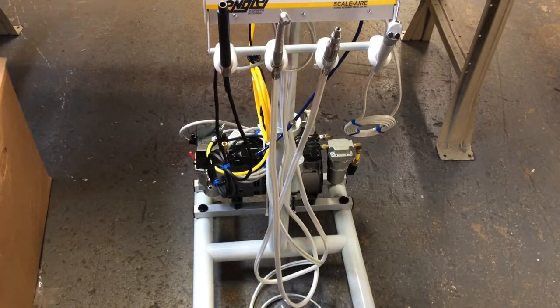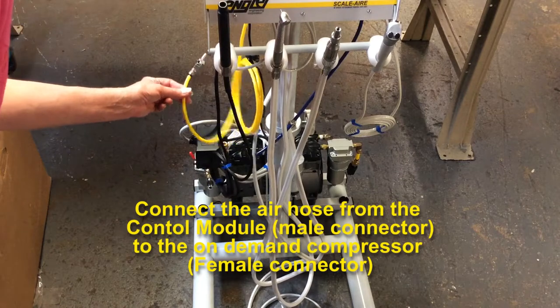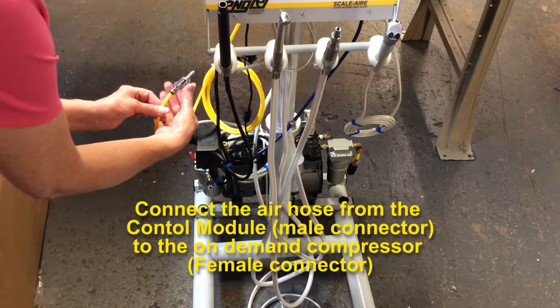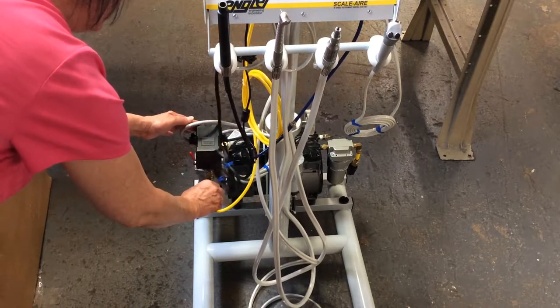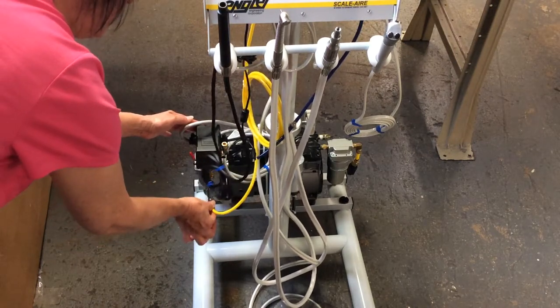To connect your air supply, take your yellow hose with the male quick disconnect. Depress the clip, push it into the female quick disconnect, let go of the clip, and you are connected.